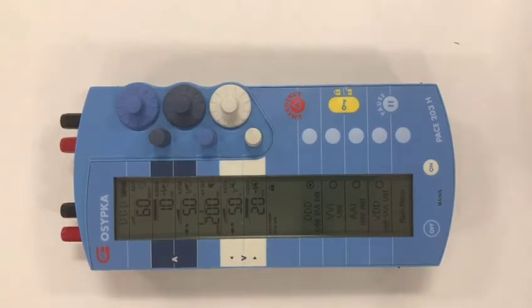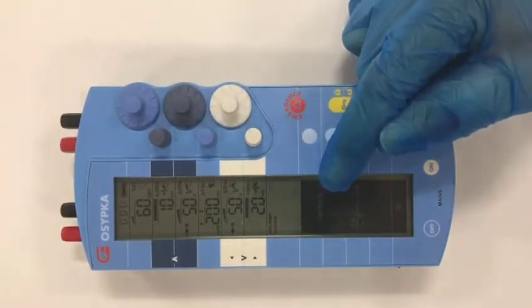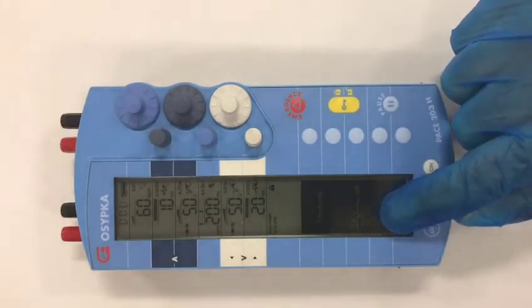To measure the impedance, all that you need to do — even when the device is locked — is to rotate one of the output controls. I'm going to rotate the ventricular control, and you can see here it says 'ventricle' in the bottom part with a formula, and at the bottom of that formula is the impedance.